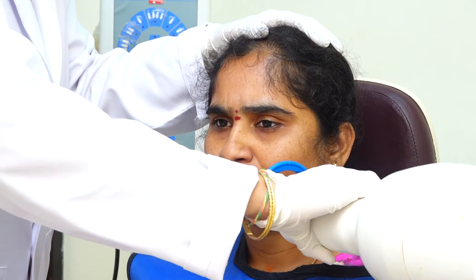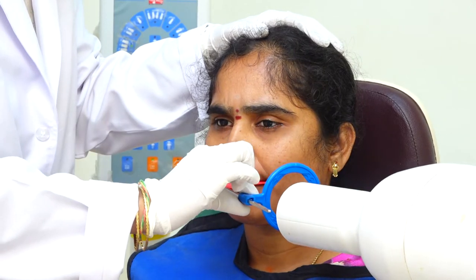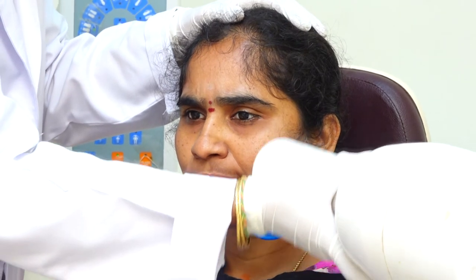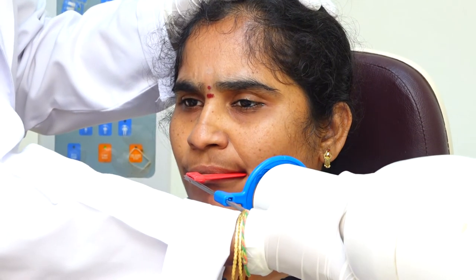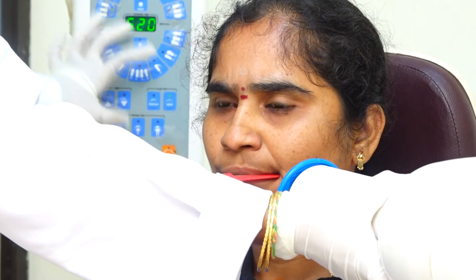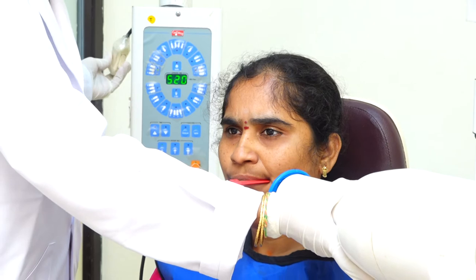This external guiding ring will guide my X-ray tube. Once after arranging, I will place my X-ray tube relative to the external ring and I will choose the milliseconds on my control panel and, once it is ready, I will shoot the film. Thank you.